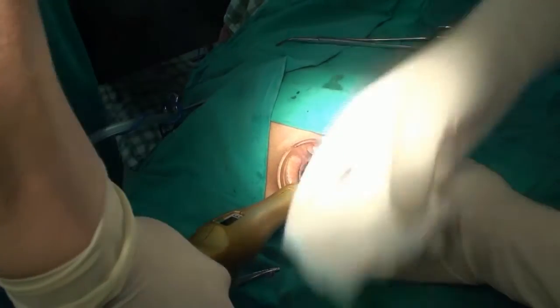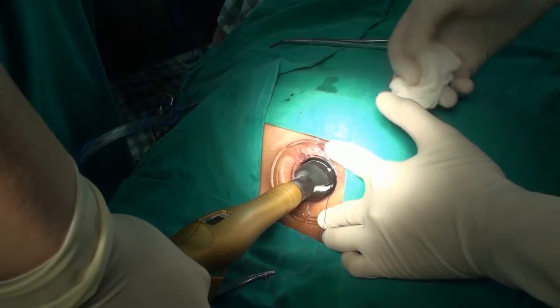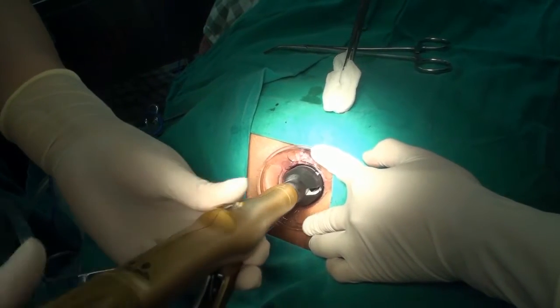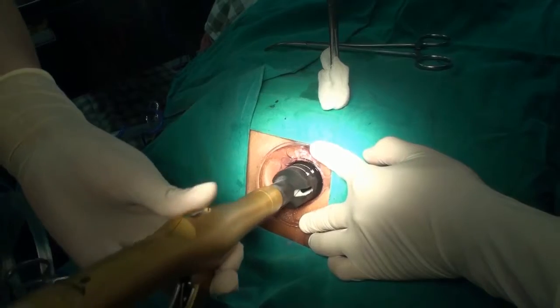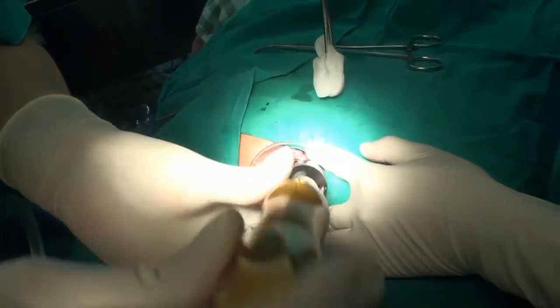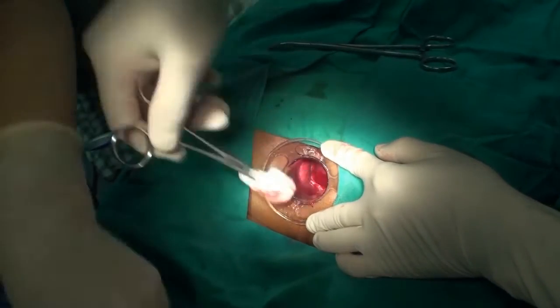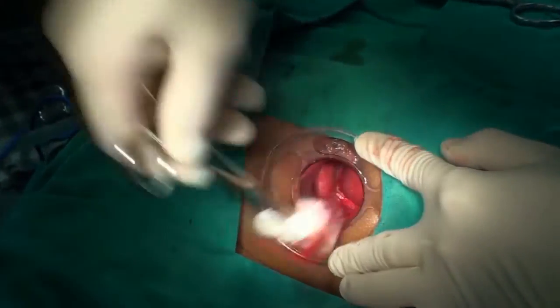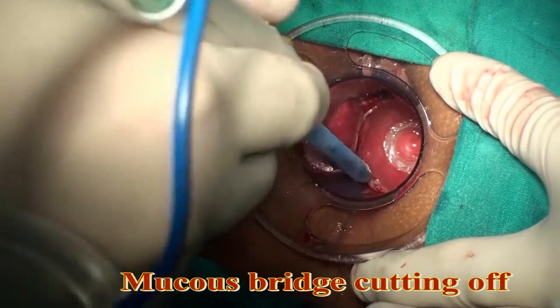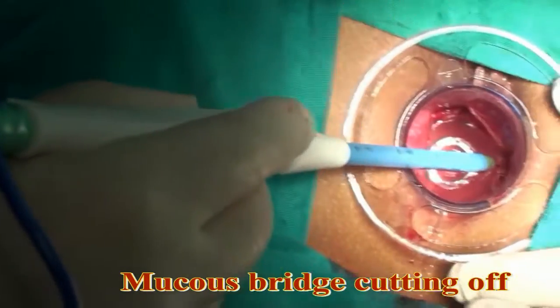We tend to hold the closed stapler in place for 30 seconds, which is needed to ensure a dry staple line. After firing the gun and removing the stapler, a mucosal bridge will be left behind between the mucosectomies. At this time, the mucosal bridges would be dissected using electrocautery.